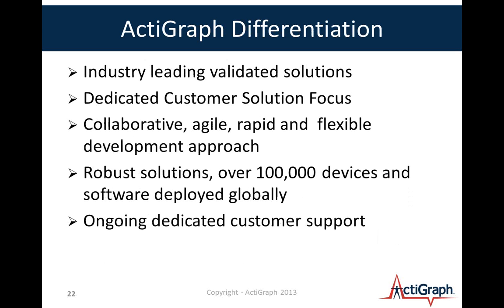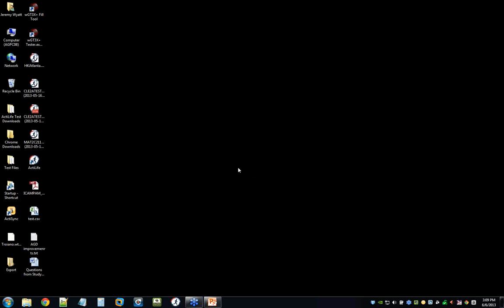So that's really the presentation for today. I'm going to do a demo next, but just a reminder about what makes ActiGraph different from the others, and we're proud of our reputation, and we want to continue to provide these solutions that meet the needs of our growing customer base. And I feel like this system is where we need to be based on what I'm hearing from customer groups. And again, I would appreciate feedback from you, because that's how we have evolved over time. We have been involved with a lot of research groups, organizations, and individuals who have given us great guidance on solutions that will help them with their day-to-day tasks and jobs. And I feel like this system, again, is heading down the right path. But if you're interested and have some great feedback, I'd love to hear it, so please get in contact with me.